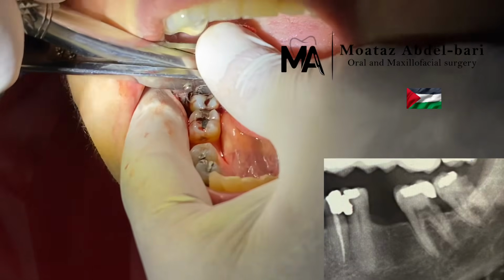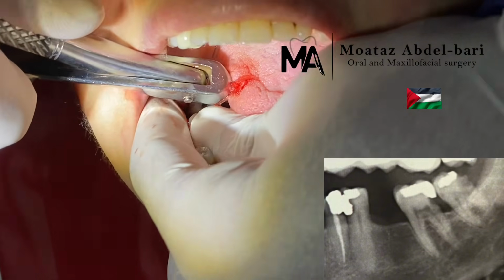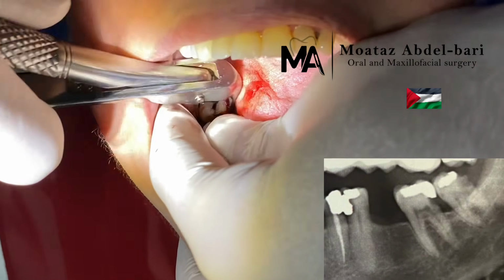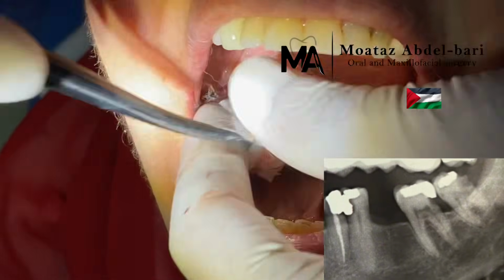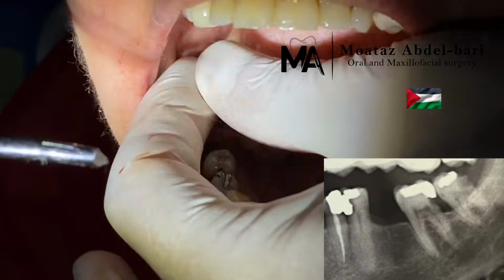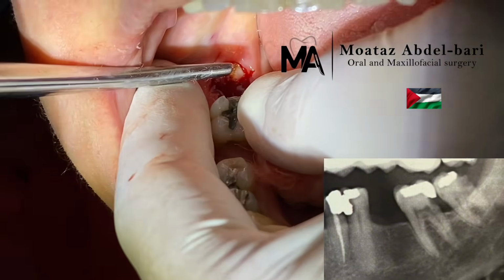Let's see what's going on. My thumb of non-dominant hand pushes the forceps apically as much as possible. You can see it is luxated and going to be extracted. But fortunately, not unfortunately, fortunately, it fractured. Despite being fractured, it is with a luxated fractured part, which will be easy in extraction by elevators.